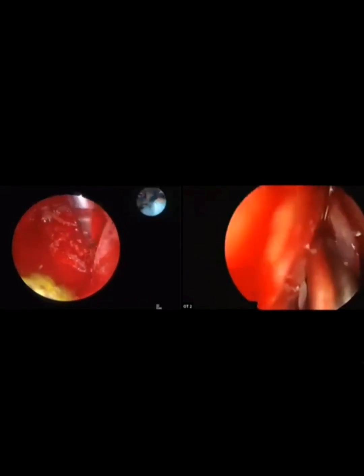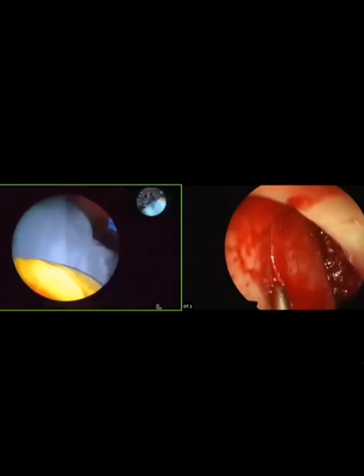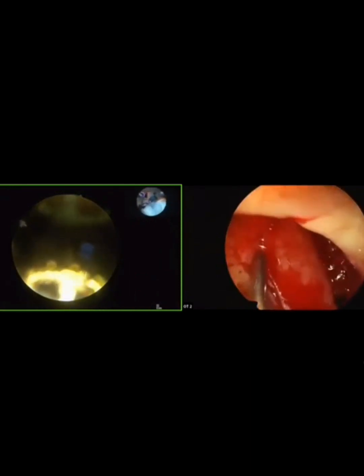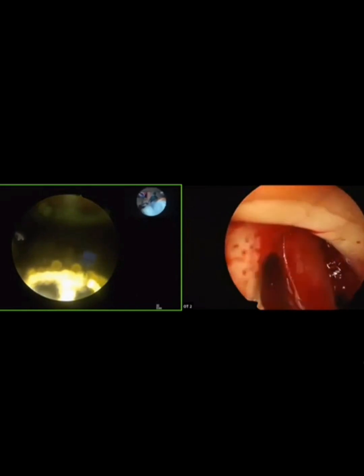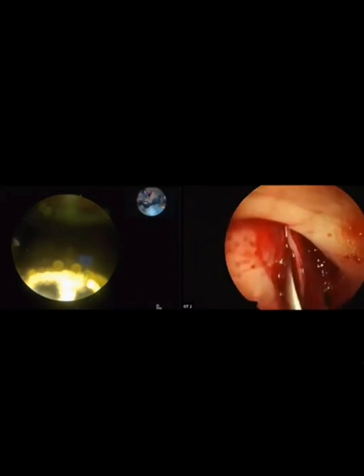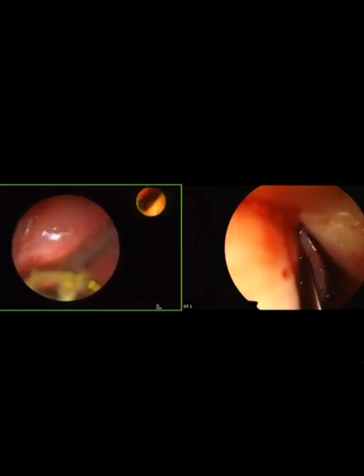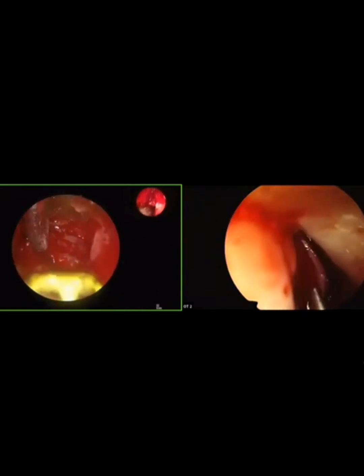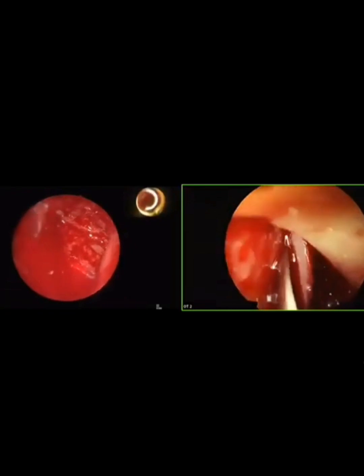Okay. 60 degrees. For juniors, already use the 120 degree whenever the 120 degree reaches. Okay. I try as much as possible to avoid CFT. Okay. Chaitri, can you hear us? Chaitri?